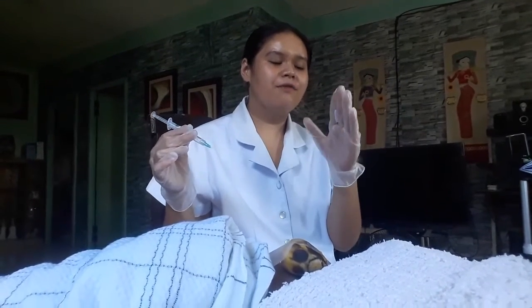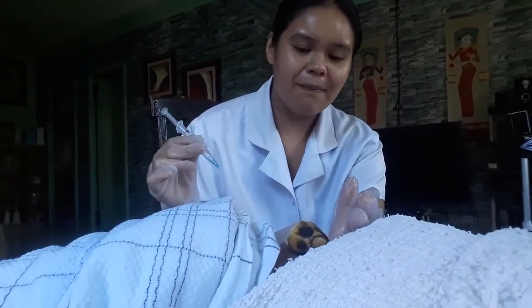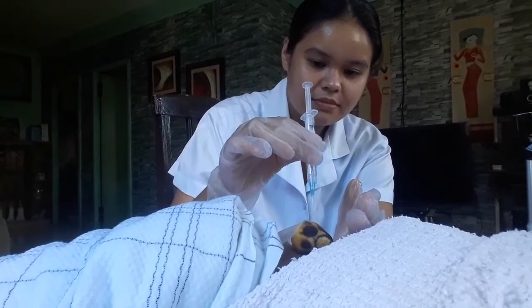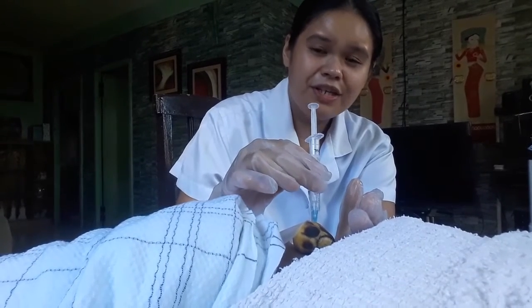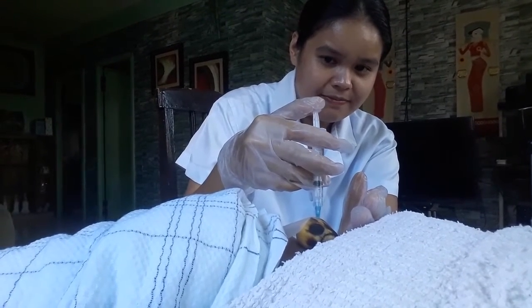And after that, using the ulnar side of my non-dominant hand, I will place it just below the injection site until I insert the needle. After inserting the needle, I will move my non-dominant hand to the end of the plunger and aspirate or inject the medication. Slowly.